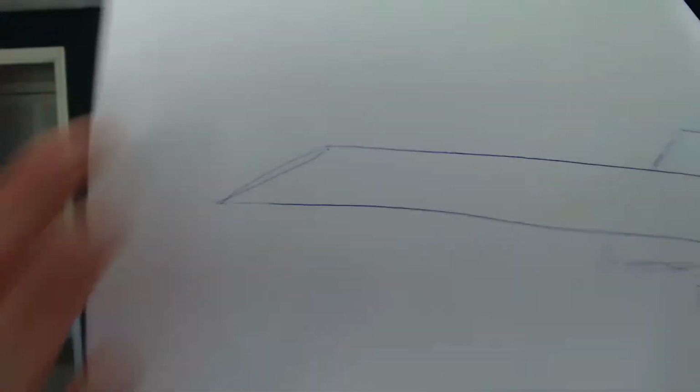So, a very, very crude drawing. This is the needle opening right there. That's the needle opening where the anesthetic actually flows out. And it's at an angle. That angle is called the bevel. It's like a beveled edge. We see this all the time when we talk about picture frames, the beveled edge.